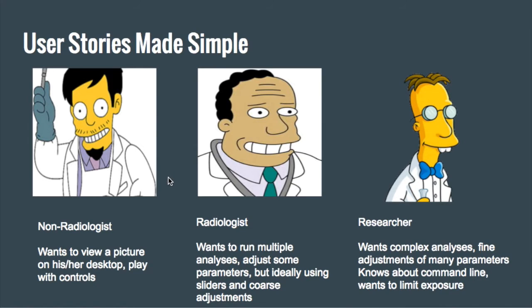To review our user stories, we have 3 principal individuals who might be using CRIS. Now, all of them would, in this case, be affiliated with Children's and involved in research or potentially clinical uses to varying degrees. You have folks who may be viewing MRIs but are really not expert in their use. For them, CRIS provides convenience more than anything else. You don't need a powerful machine to be able to do some very, very basic image processing.